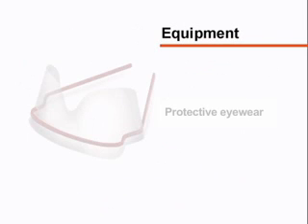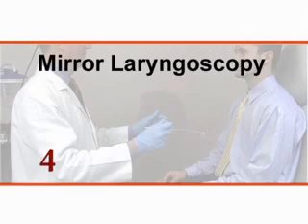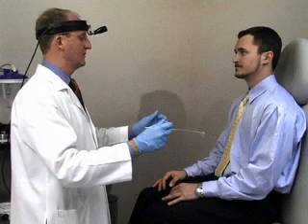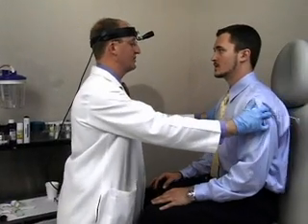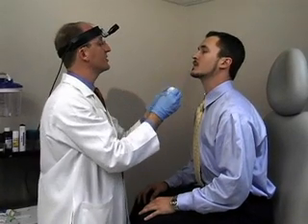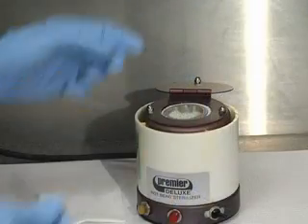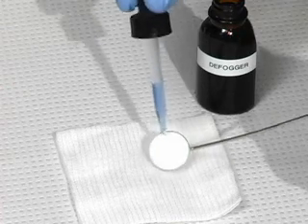During laryngoscopy, the examiner should use protective eyewear to prevent exposure to bodily fluids in the event of a sudden sneeze or expectoration on the part of the patient. The patient should be seated opposite the examiner. Ask the patient to uncross his or her legs and lean gently forward. Ask the patient then to open the mouth widely and protrude the tongue. Warm the mirror to just above body temperature or coat the mirror with an anti-fogging solution.